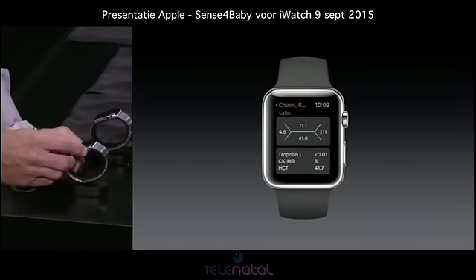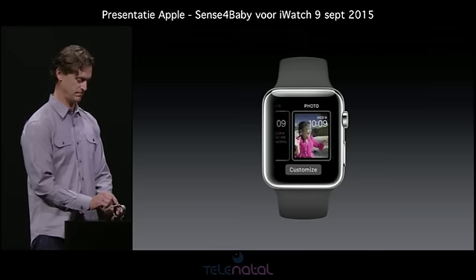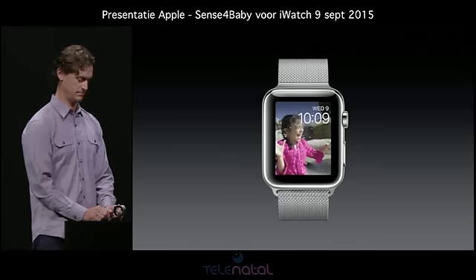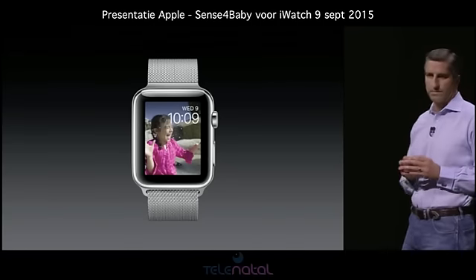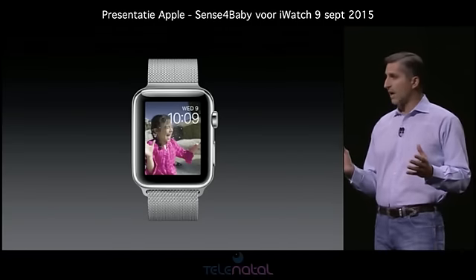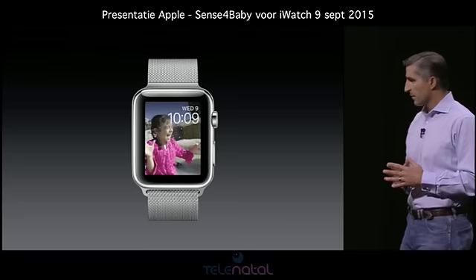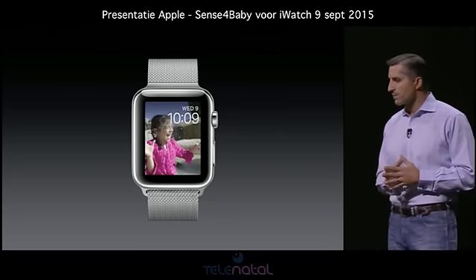Okay, we're going to switch gears. Let's talk about how Airstrip with Apple Watch will change how doctors communicate with their patients. Now, Airstrip has been used already to monitor over 3.5 million pregnant women in the hospital. But with our new product, Sense4Baby, we can now monitor these women at home leveraging Apple Watch.